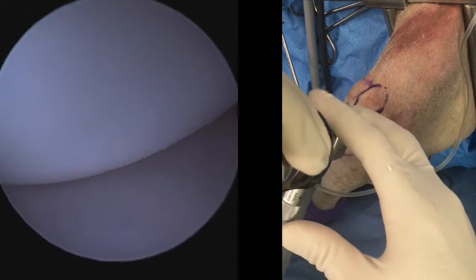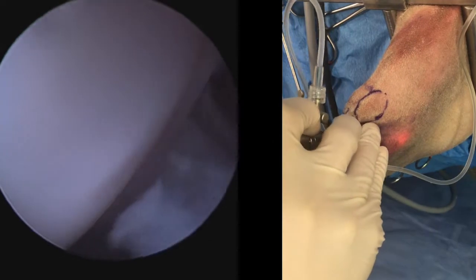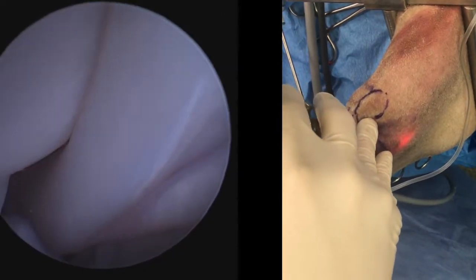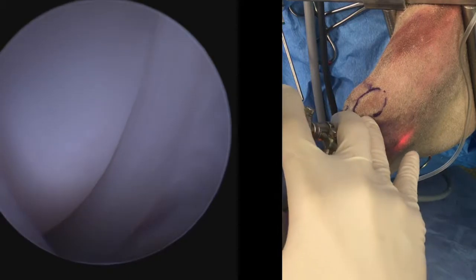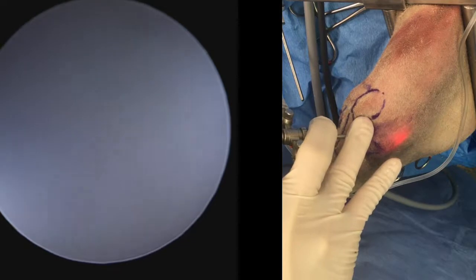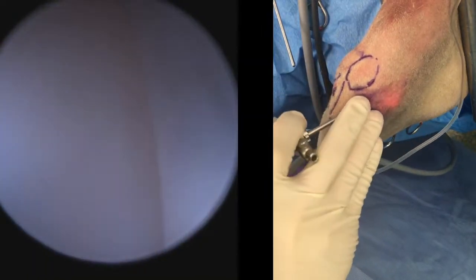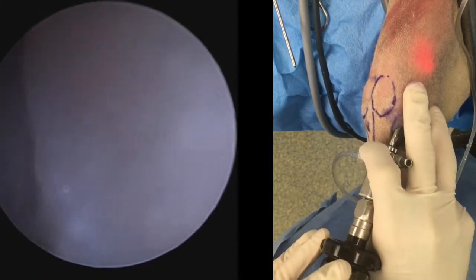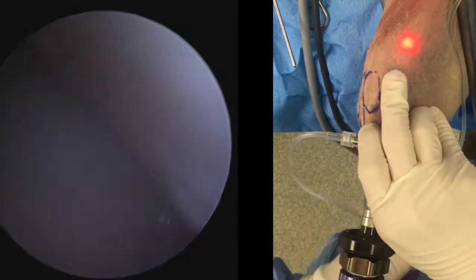We'll reposition our light post to the medial position so we're looking laterally. If we telescope our arthroscope in slightly further caudally, here we have the popliteal tendon hugging the caudal aspect of the lateral meniscus. Telescoping out now into the field of view, we have the long digital extensor tendon. By dropping the camera and angling the scope up, it is possible to telescope into the lateral stifle pouch.